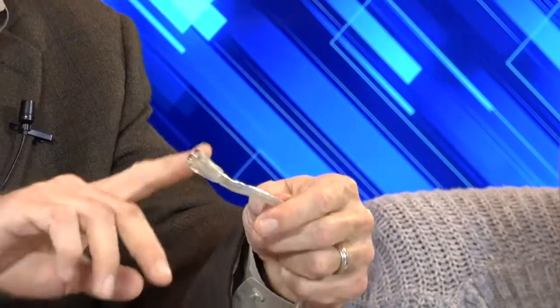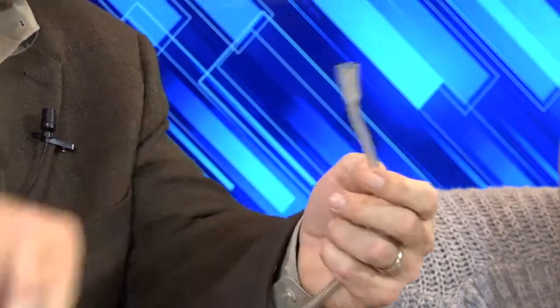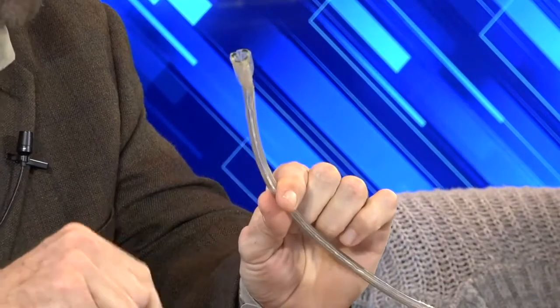At any rate, so we had a balloon on the end. We did have up to a 20-degree angle that we offered before, and a stainless steel coil reinforced cannula.